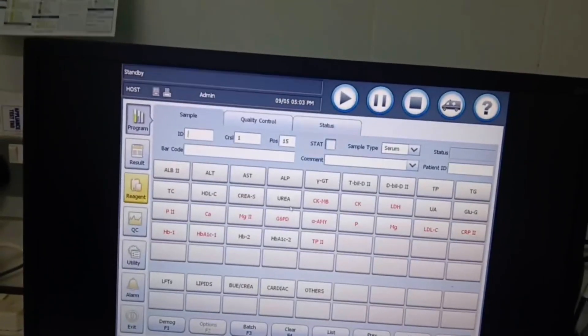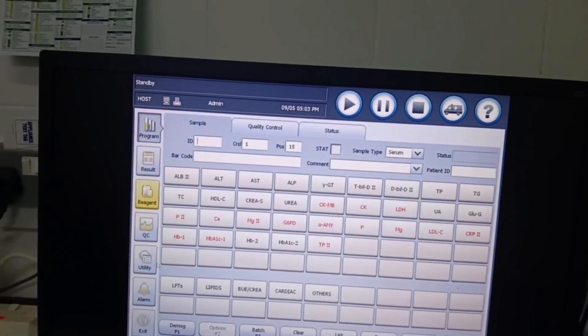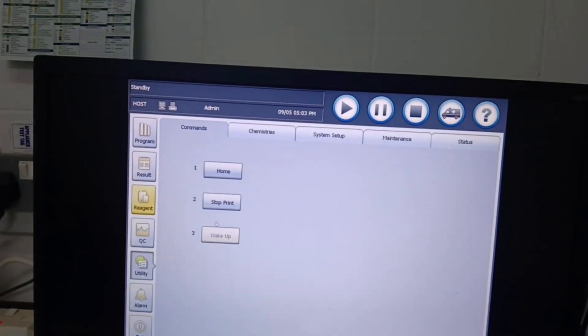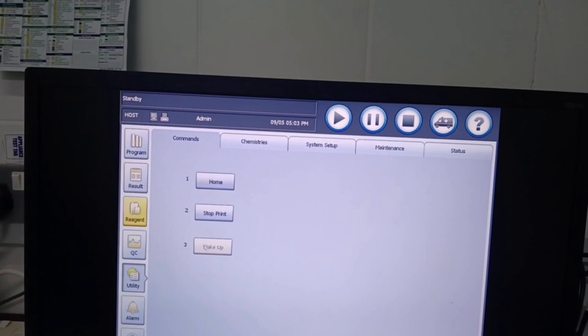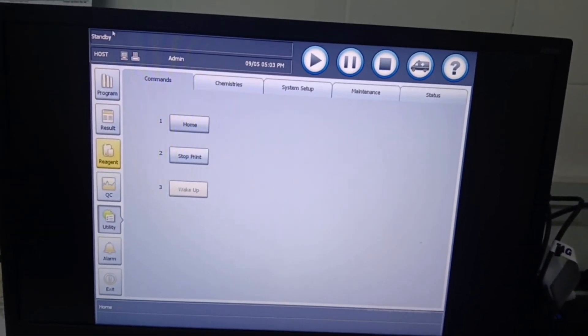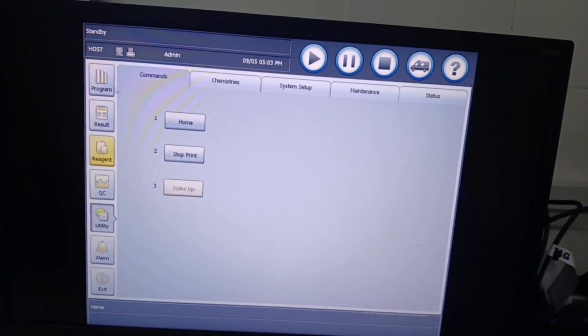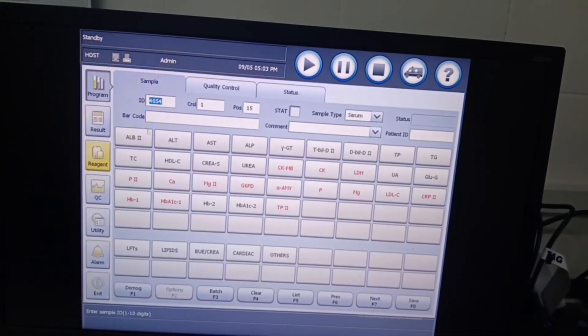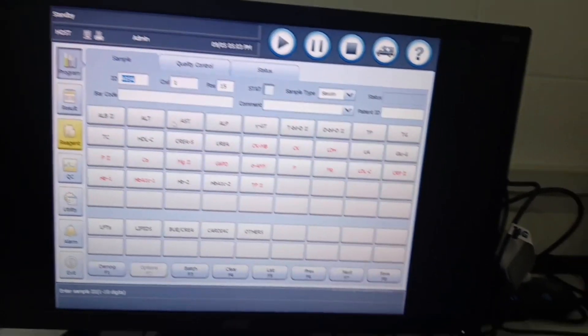Earlier our machine was on sleep, so we go to utility, wake it up to ensure it's on standby before any analysis can be done.